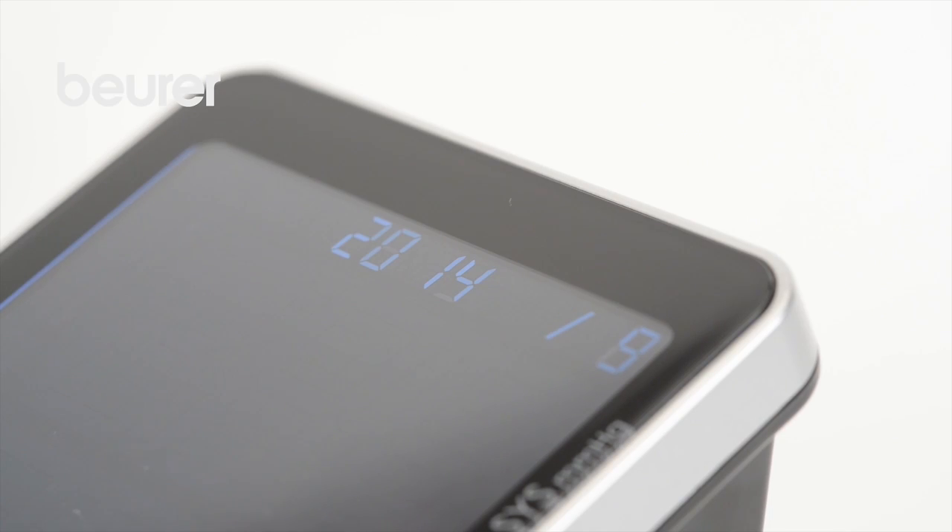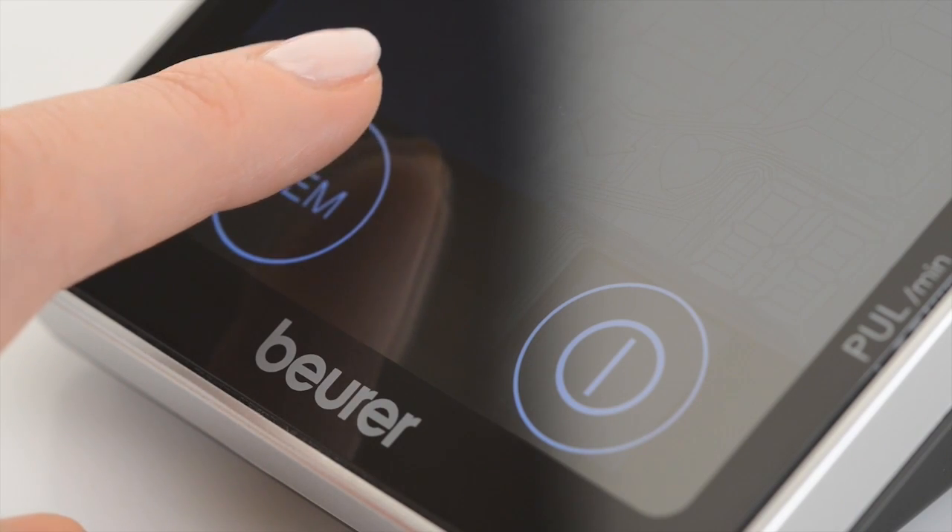Set the month, day, hour, and minute in the same way. Press start stop to confirm your selection each time.